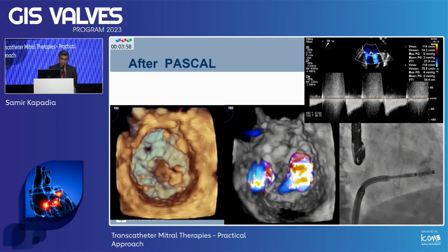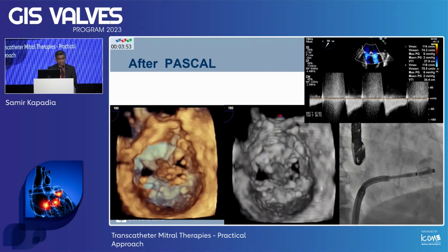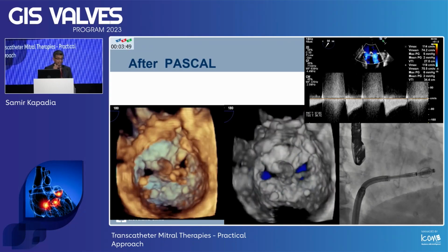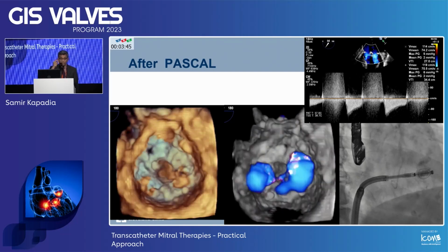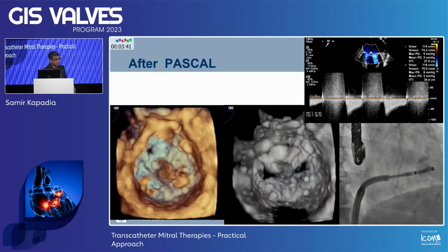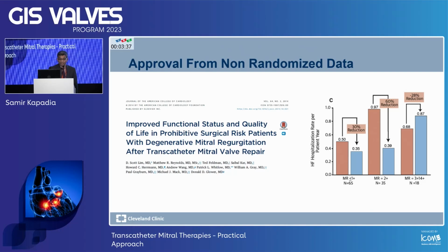But if you have enough experience and the device is available, we use a Pascal device. So I used a Pascal device. Pascal has a little bit of a spacer in between so that the size does not get so small. And as you can see, this is an outstanding result with one Pascal device right in the middle.